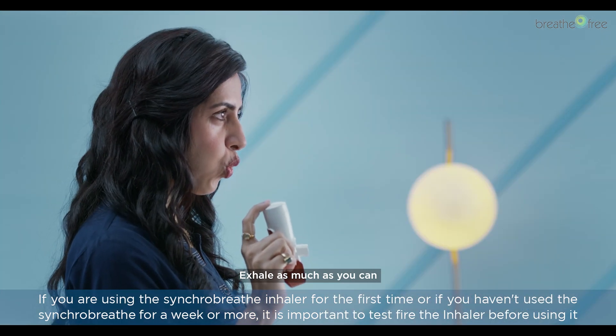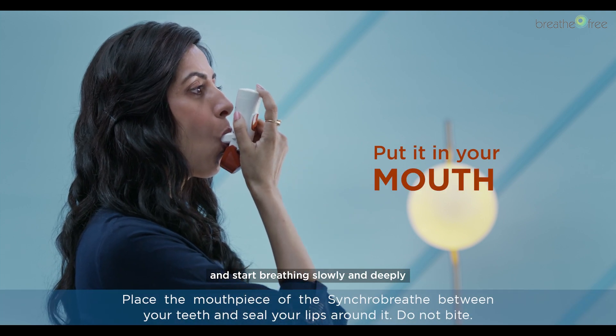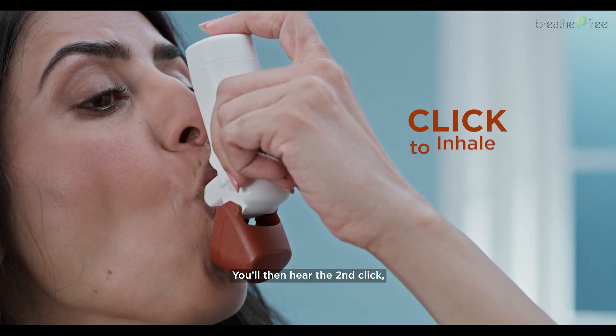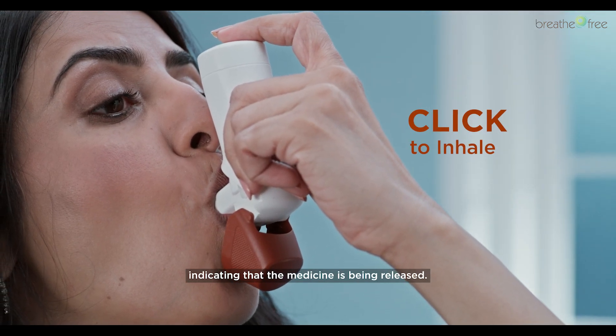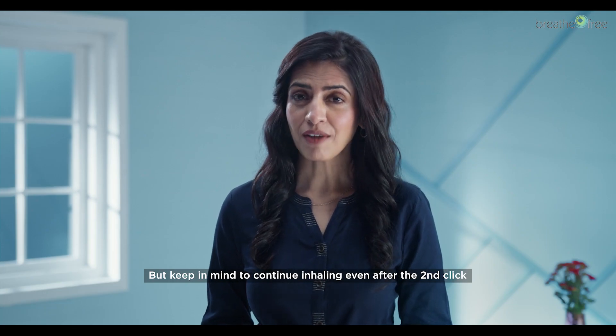Exhale as much as you can before you put the SynchroBreathe in your mouth and start breathing slowly and deeply through the mouthpiece. You will then hear the second click, indicating that the medicine is being released. But keep in mind to continue inhaling even after the second click.